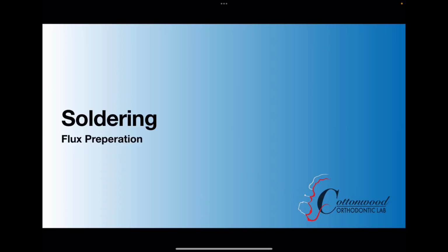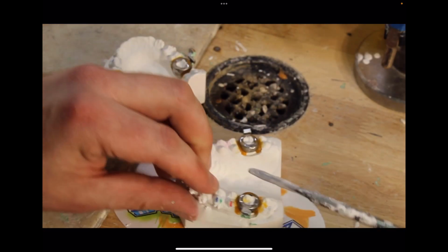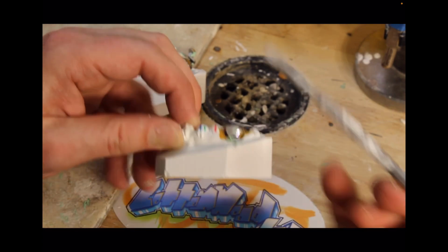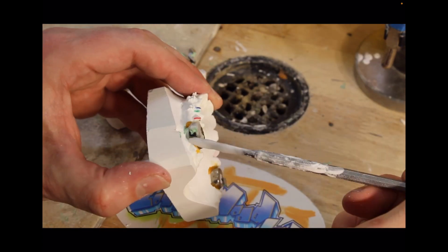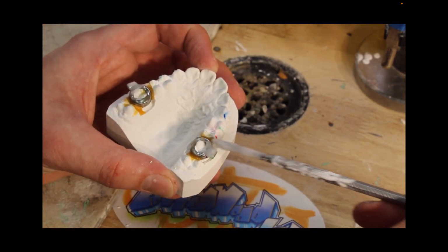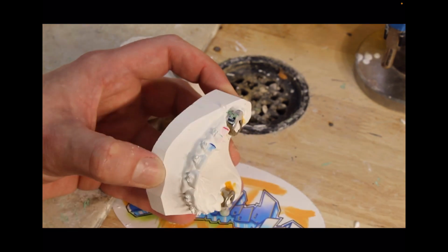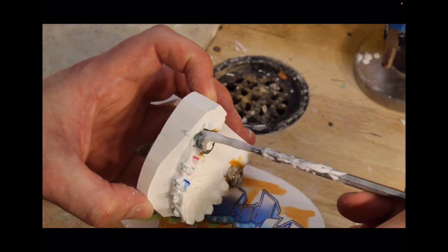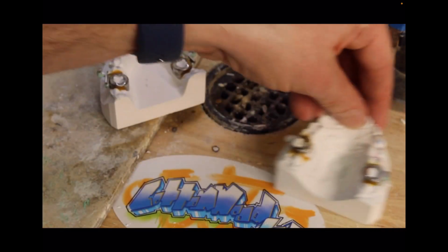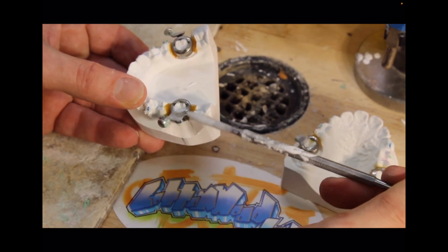Okay, there you go. Next, let's do flux preparation. That's pretty straightforward as well. Once again, we've sped this up to 1.5 times. We're adding the flux in a quantity that we would like to see the solder be on there. That's kind of the rule of thumb. So pretty straightforward. Nothing too crazy here. There you go.